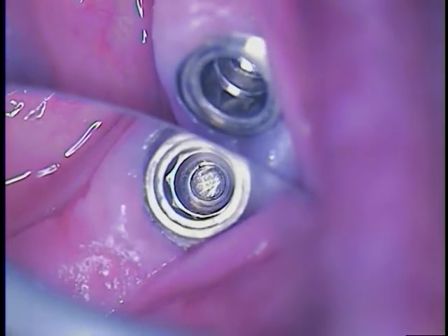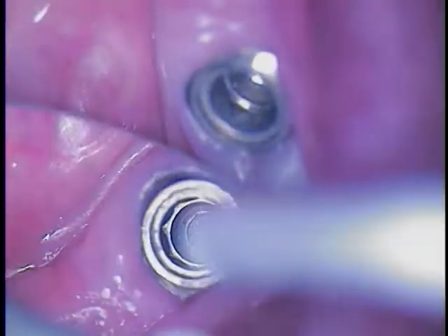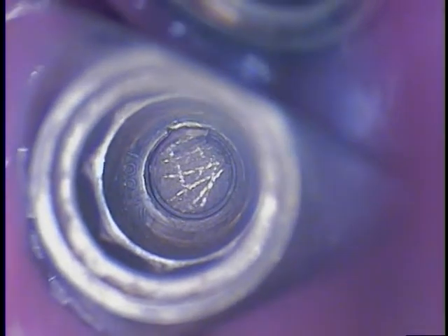We're going to take a micro suction and look inside. We can notice immediately there are some scratches here. Let's take a look at these. There was a prior attempt. I try to classify these fractures — this one's right at the level of the first thread, but there is some damage to the implant thread, just very minor.